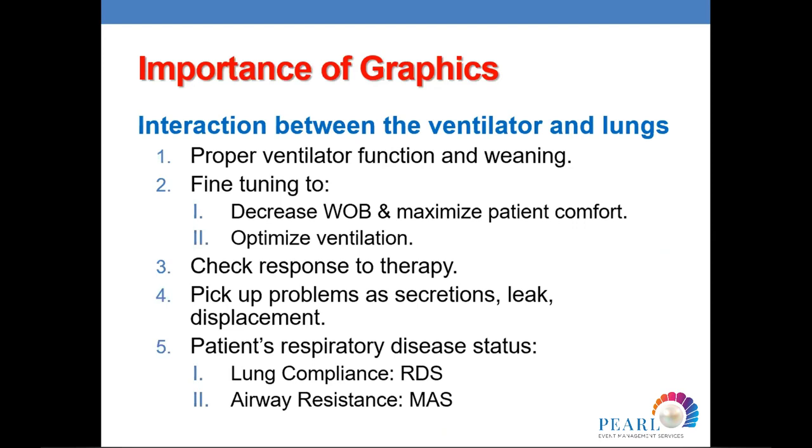So why do we need the graphics? Before, we were just putting the patient on the ventilator and checking the blood gas and the X-ray, and we don't know what's going on. But with the graphics, you know what's going on interactively between the ventilation and the lungs. And this will help us a lot. Why? Because we can properly know the ventilator function, and we can wean. We can fine tune to decrease the work of breathing and maximize patient comfort. We can optimize ventilation. By the graphics, we can check the response to therapy.